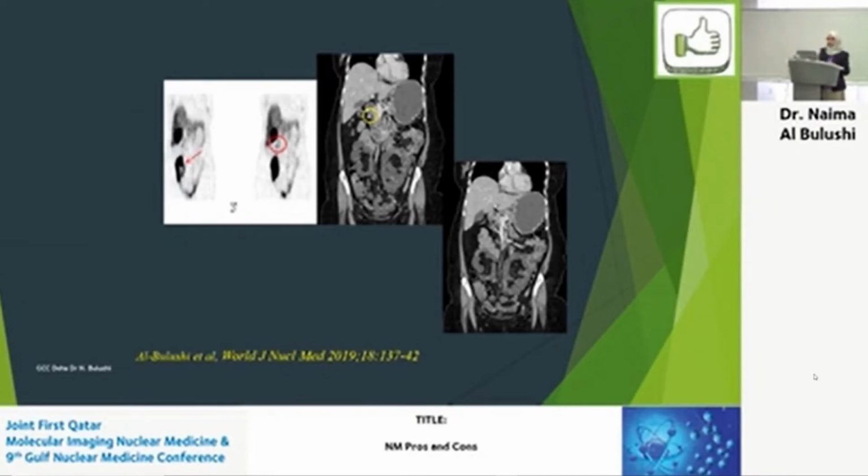No, it was reported as, this is a collapsed, non-distended bowel, and this lymph node looks normal. We insisted it's not normal. In the MDT, the patient went for gallium DOTA scan, and actually this wasn't normal. It showed uptake in the mid-small intestine, in this lymph node, and also in the pancreas. And the patient went for Whipple. So this wasn't really normal.